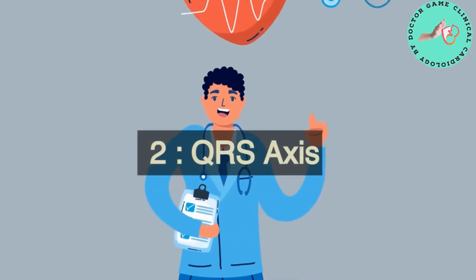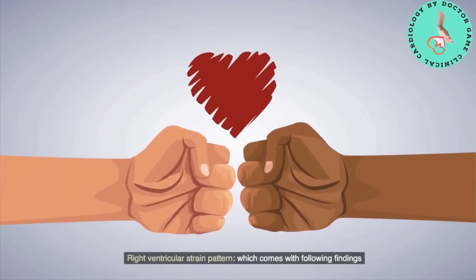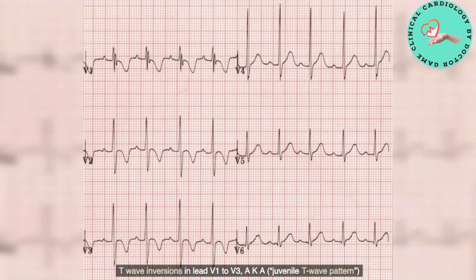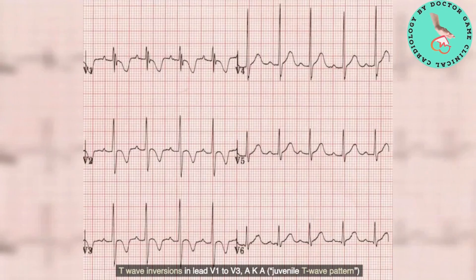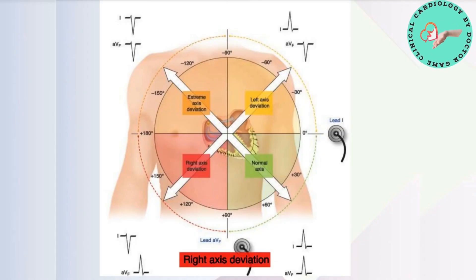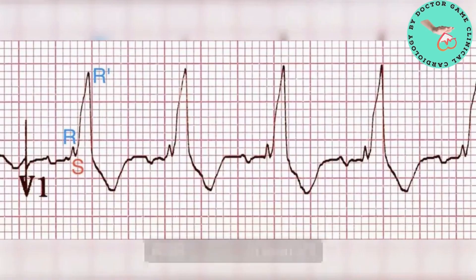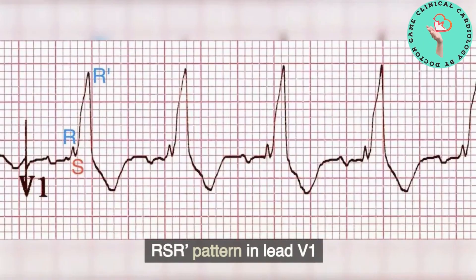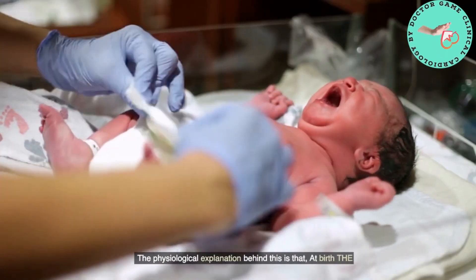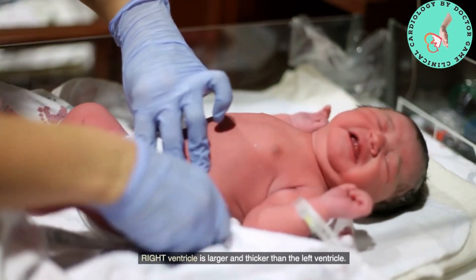Two: QRS axis — right ventricular strain pattern, which comes with the following findings: T-wave inversions in leads V1 to V3, also known as the juvenile T-wave pattern; right axis deviation; dominant R wave in lead V1; and RSR' pattern in lead V1. The physiological explanation is that at birth the right ventricle is larger and thicker than the left ventricle.